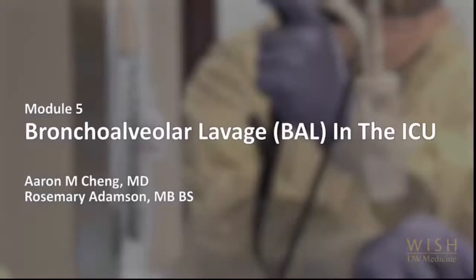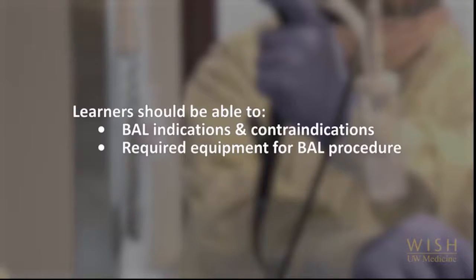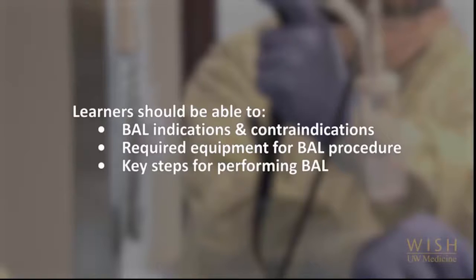This module introduces the technique of bronchoalveolar lavage in the ICU setting. Commonly referred to as BAL, it is performed using flexible bronchoscopy. Upon completion of this module, the learner will be able to identify the common indications and contraindications for performing BAL in critically ill patients. He or she will be able to identify the required equipment necessary to perform this procedure, and the learner also will be introduced to the steps necessary to execute this procedure safely.